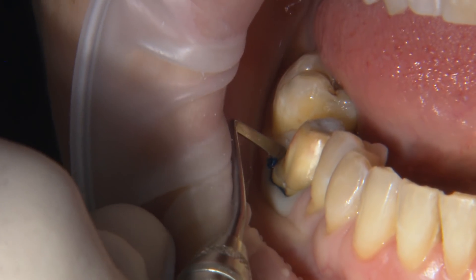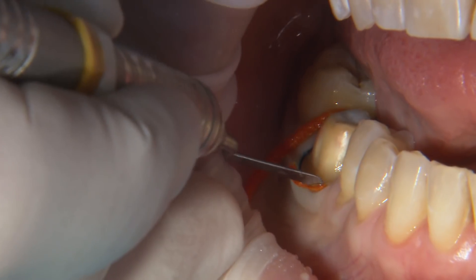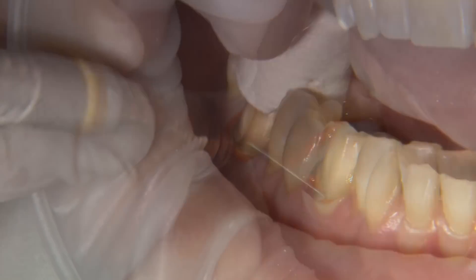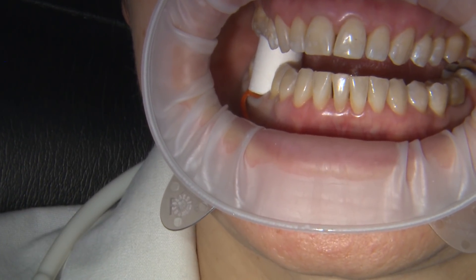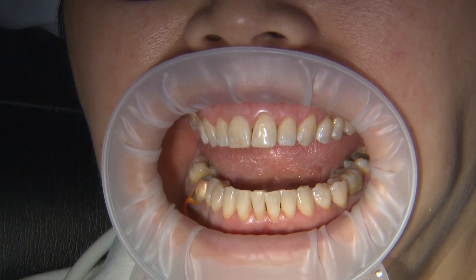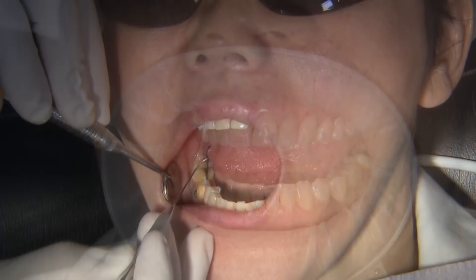The first method recommended by our doctors is the dual cord technique. The initial cord is packed, preferably with a hemostatic agent impregnated into it, and cut to exactly contour the margin. A second cord is placed over the first with a little extra tail left hanging to make it easy to remove before scanning. As a secondary retraction step, a compression cap can be placed and bitten into for two to seven minutes. These caps come in a variety of sizes and anatomical designs. After the patient bites on the cap for the appropriate time, it can be removed and the top cord taken out. Give the tooth a quick air blast to remove any debris or saliva and check that the remaining cord does not cover the margin.